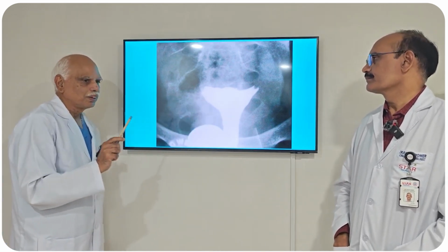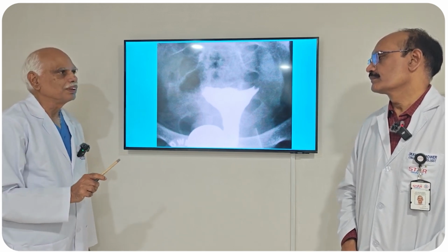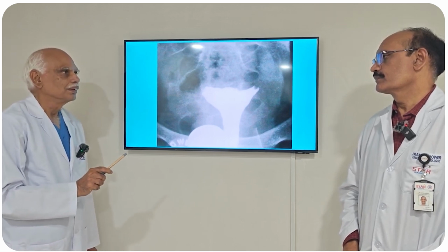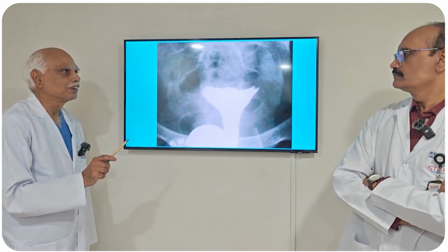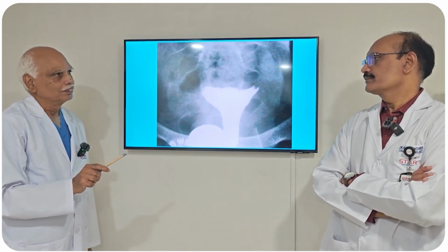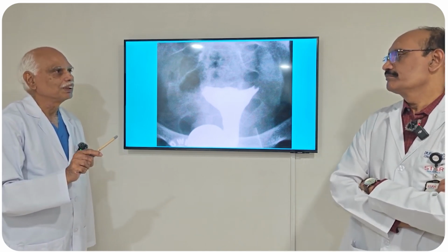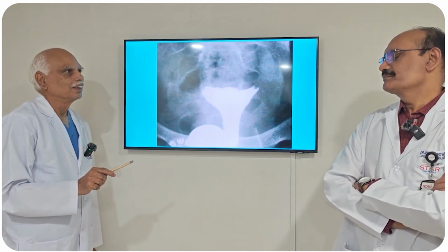So it's called a proximal tubal block or cornual block. So this is the place where the role of our interventional technique of catheterization comes in. These three words are used: fallopian tube catheterization, fallopian tube cannulation, and there is another word, FTR, which is recannulation.